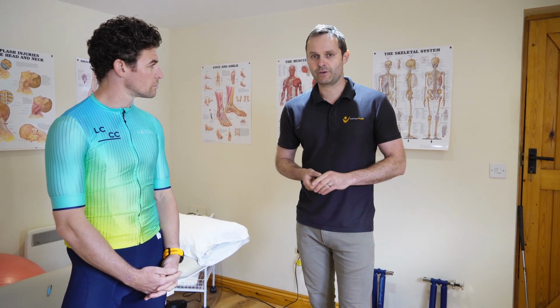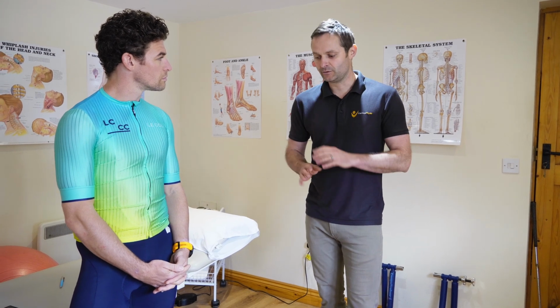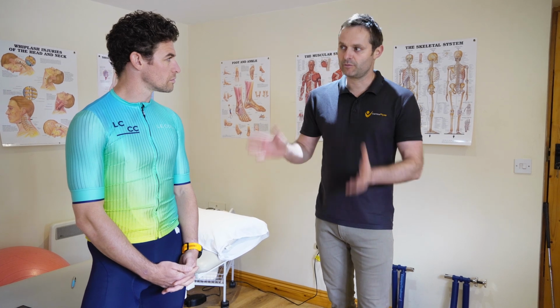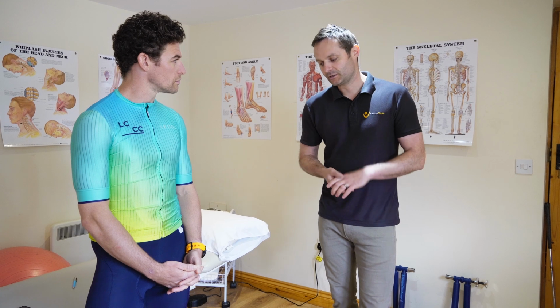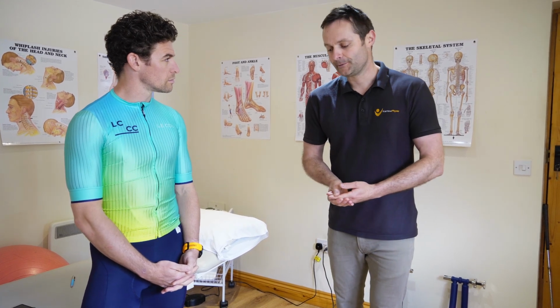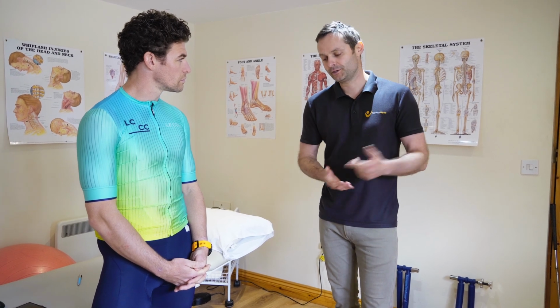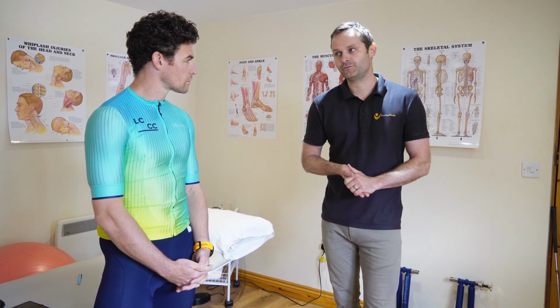But don't think that footbeds are going to solely fix your knee pain. It is one of many factors of the bike fit, and we have to look at the rider as a global approach, look at many different areas of the knee because it's so complex, establishing the problem of the knee pain and going from there. And like I say, tick the boxes, get the basics covered, and if everything else has been covered, that would be a good time to then try some footbeds.